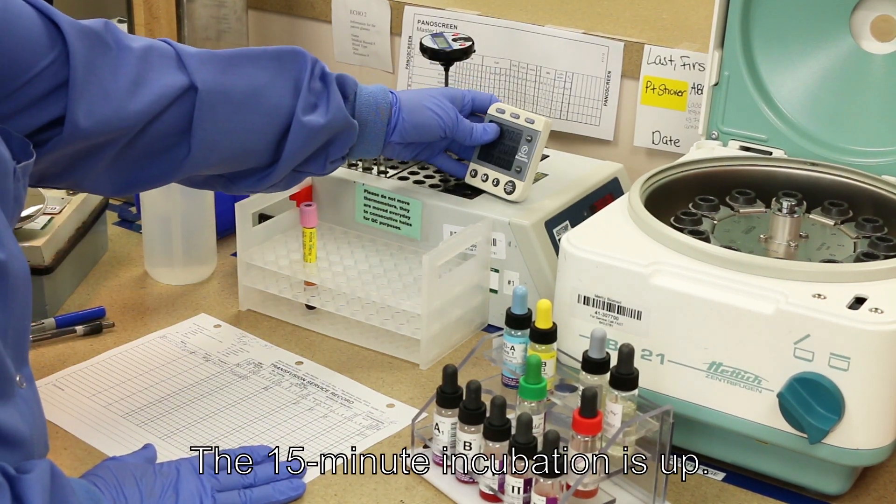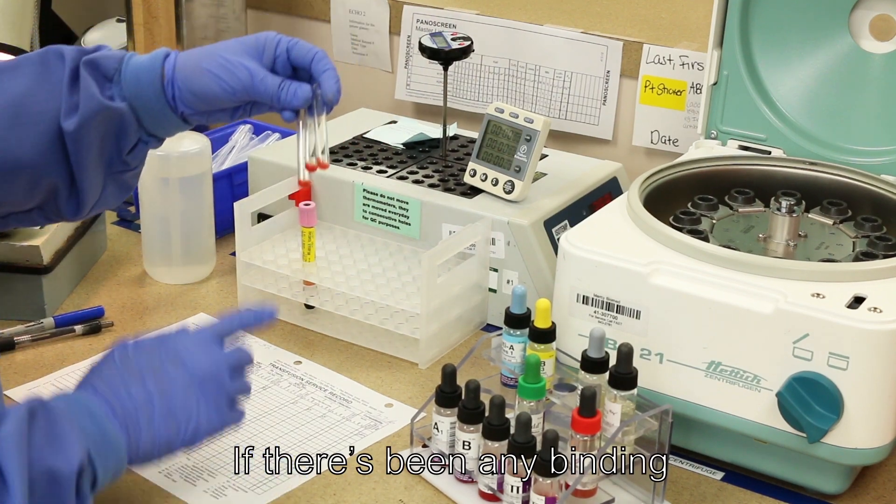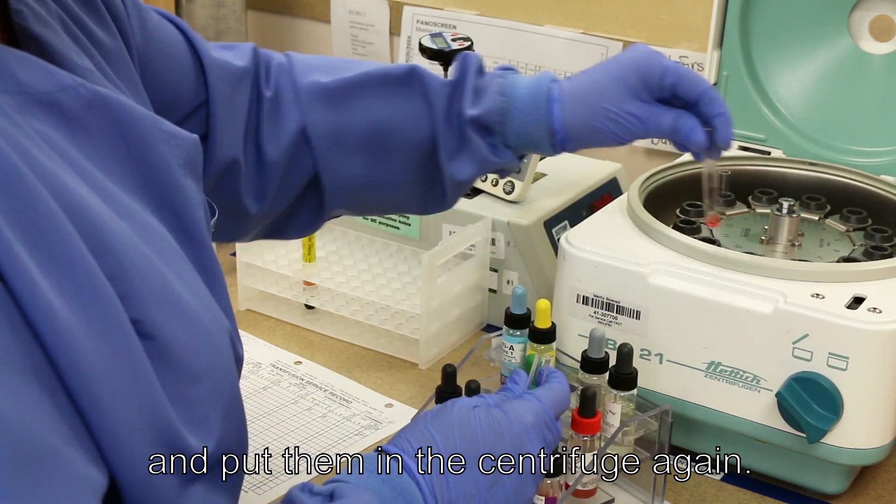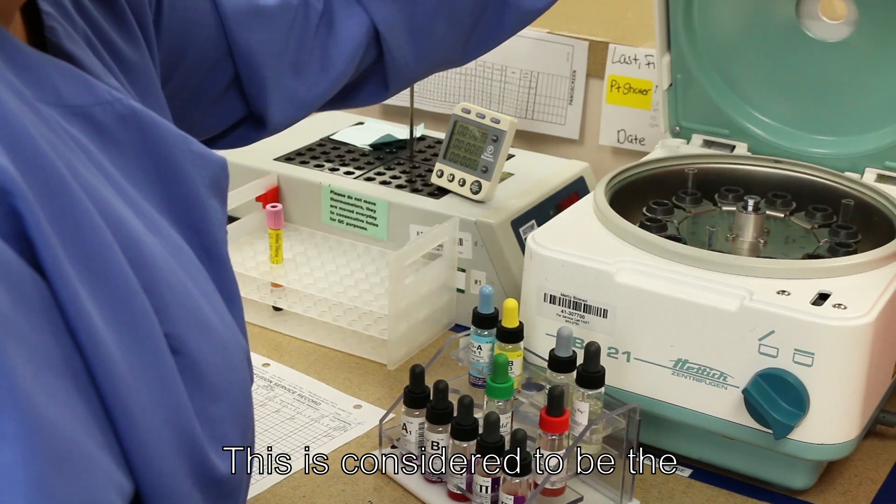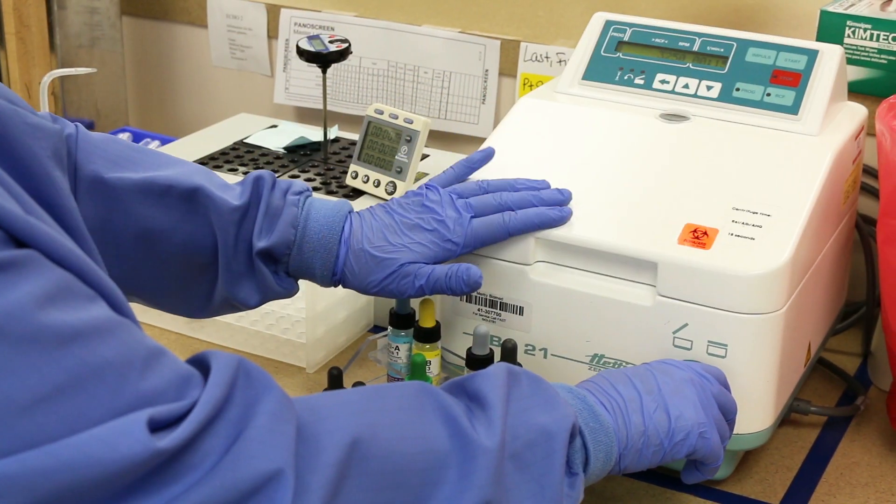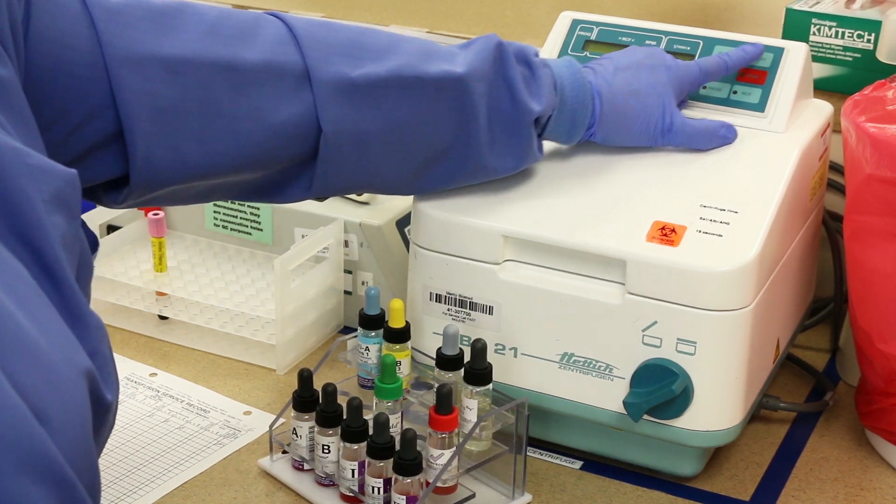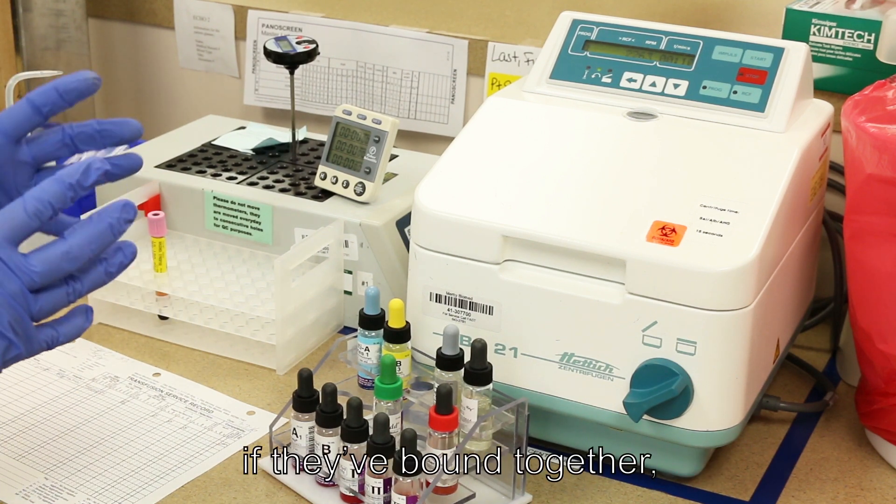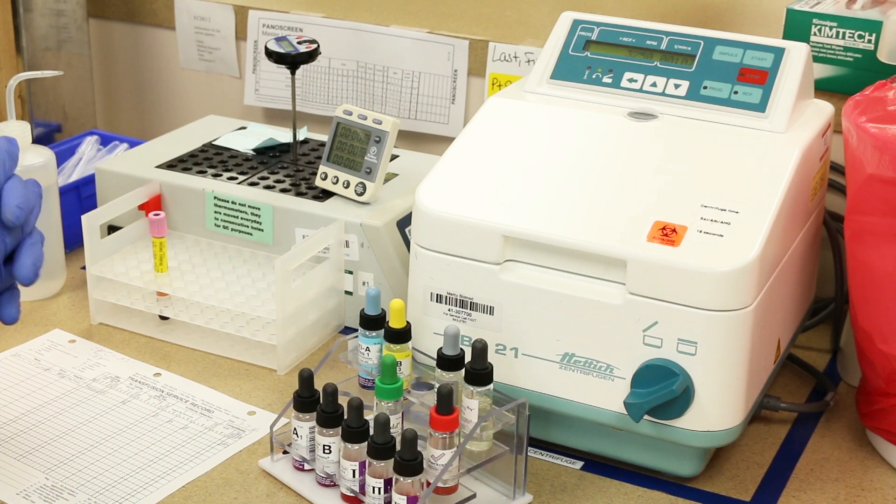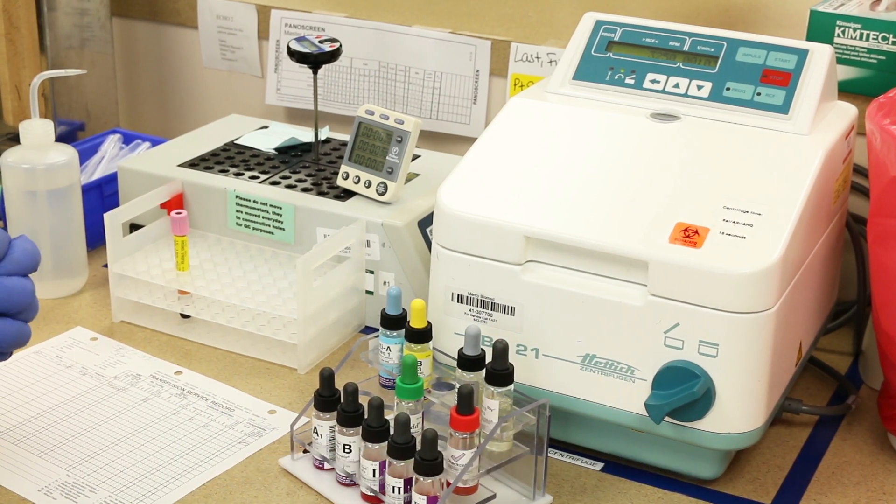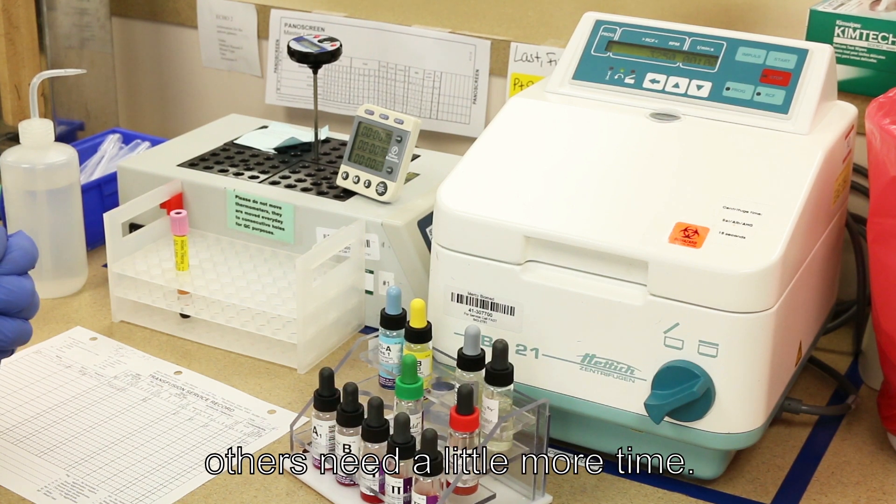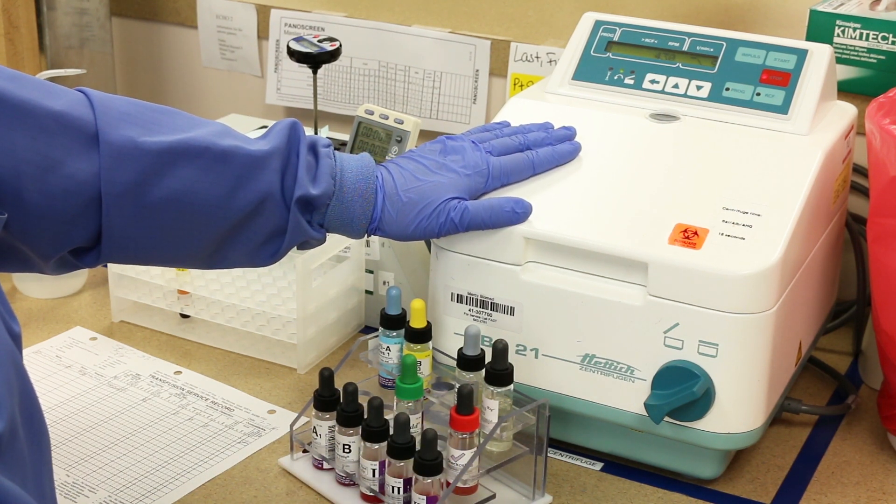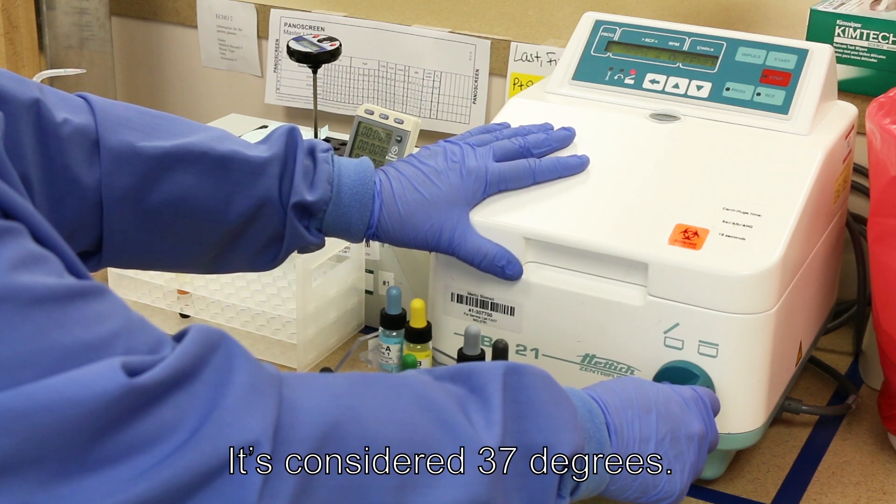So our timer just went off. 15 minute incubation is up. If there's been any binding of the antigen antibody, I need to spin that reaction so that I can visually see it. So I need to take my tubes and put them in the centrifuge again. This is considered to be the 37 degree phase, making a triangle. Same spin time and 15 seconds. What we're doing here is allowing the antigen antibody, if they bound together, we're forcing that reaction to happen. That's what the incubation was for, to allow the antibody a chance. Some antibodies can react right away. Others need a little more time. This is our second phase. It's considered 37 degrees.